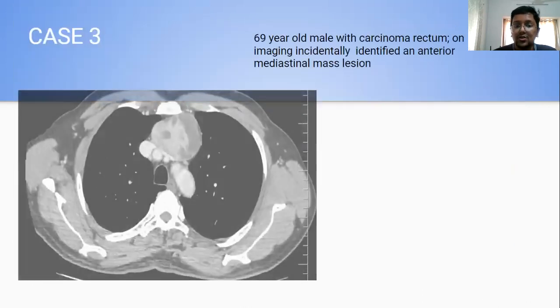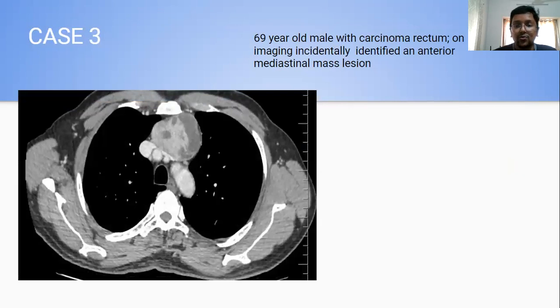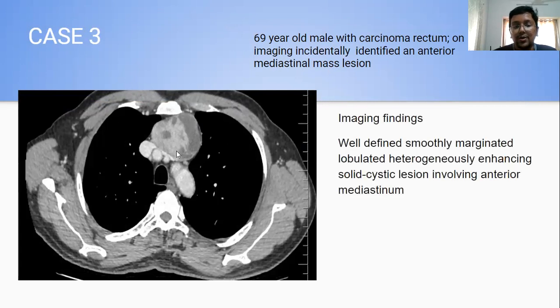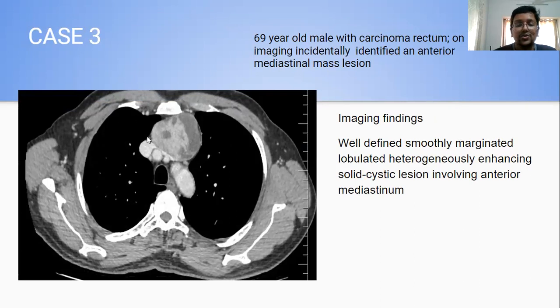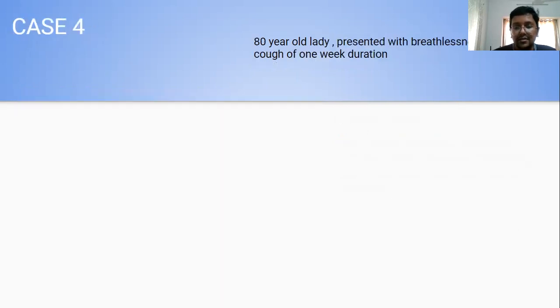My third case was also a type A thymoma — a 69-year-old male with carcinoma rectum, where the anterior mediastinal lesion was identified incidentally. This was a solid-cystic lesion with predominant solid component and no calcifications. It was compressing the left brachiocephalic vein and, to some extent, the superior vena cava. However, there was no evidence of vascular invasion. Even though it was abutting the manubrium sterni, there was no evidence of erosion or lysis of bone, and no metastases.